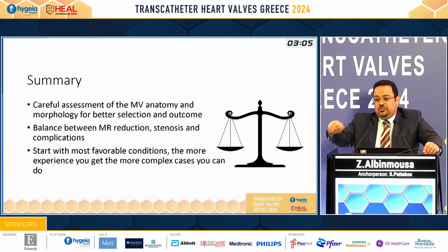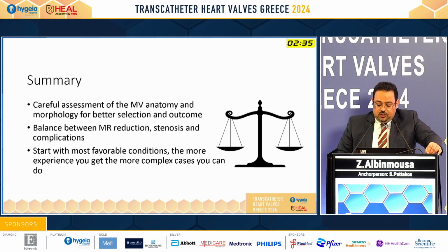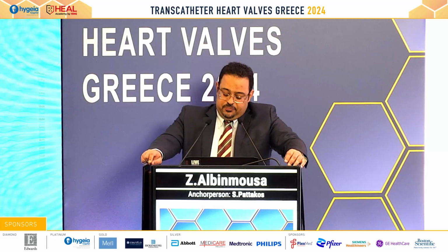I will conclude that careful assessment of the mitral anatomy and morphology is needed for better selection and outcome. Frequently you have to balance between MR reduction, stenosis, and complications. If you are starting your mitral valve intervention, start with more favorable conditions, and as your experience grows, you can do more complex cases. And by this, I would like to thank you for listening. Thank you.